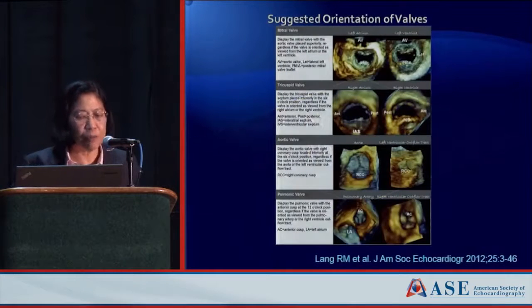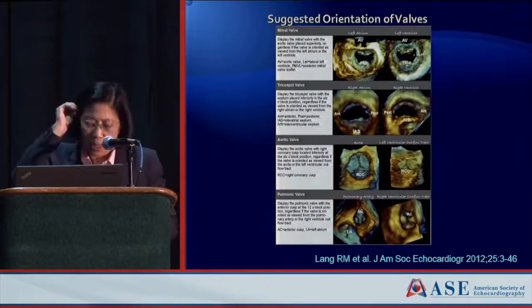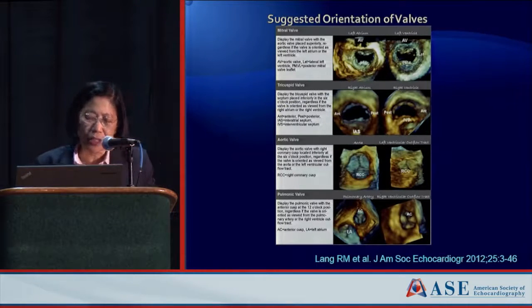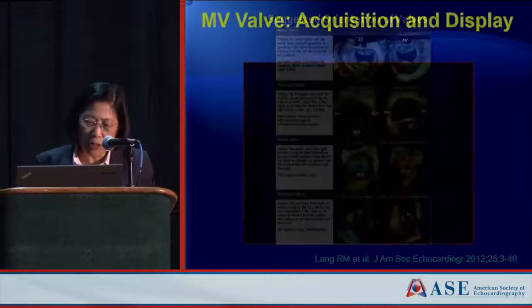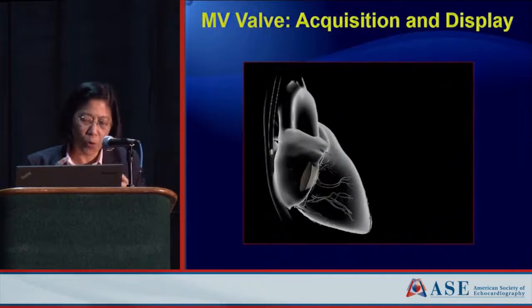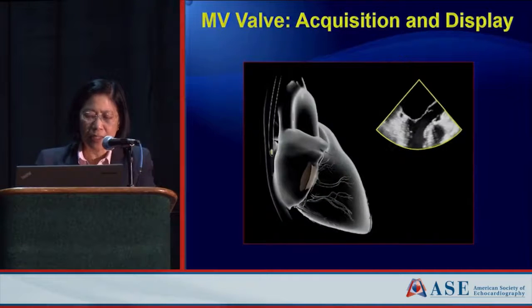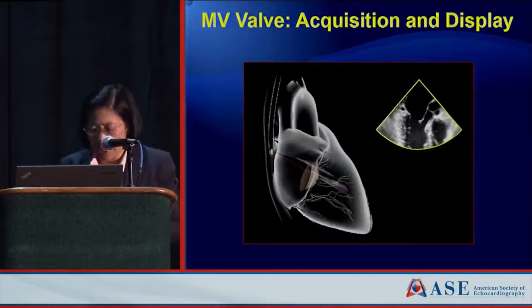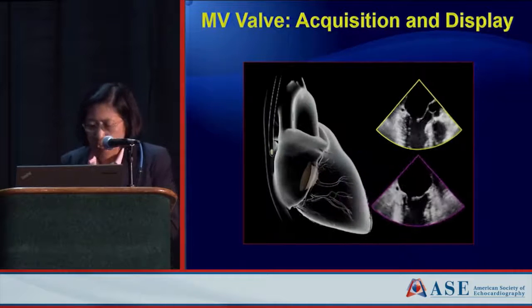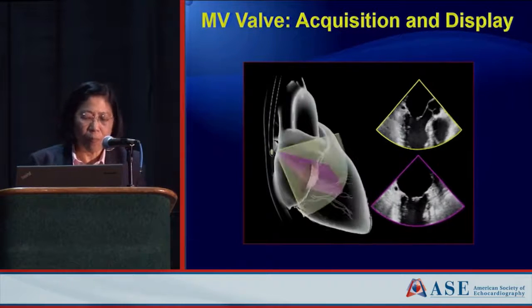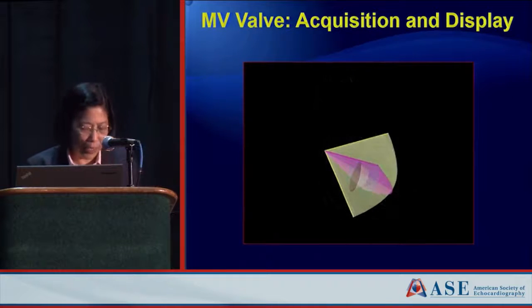For new image navigation, we have our 3D guidelines — taken from Roberto Lang's guidelines as presented by Wendy Tsang — looking at the orientation of the valve and how we acquire or attempt to get the three-dimensional volume of the mitral valve. Usually you start with a biplane view, then use a user-defined volume to get the whole valve in frame.